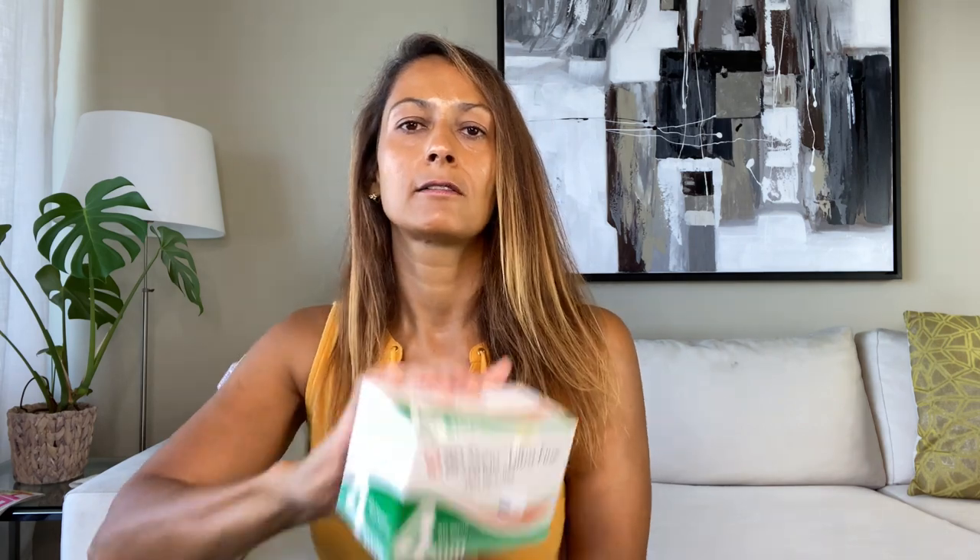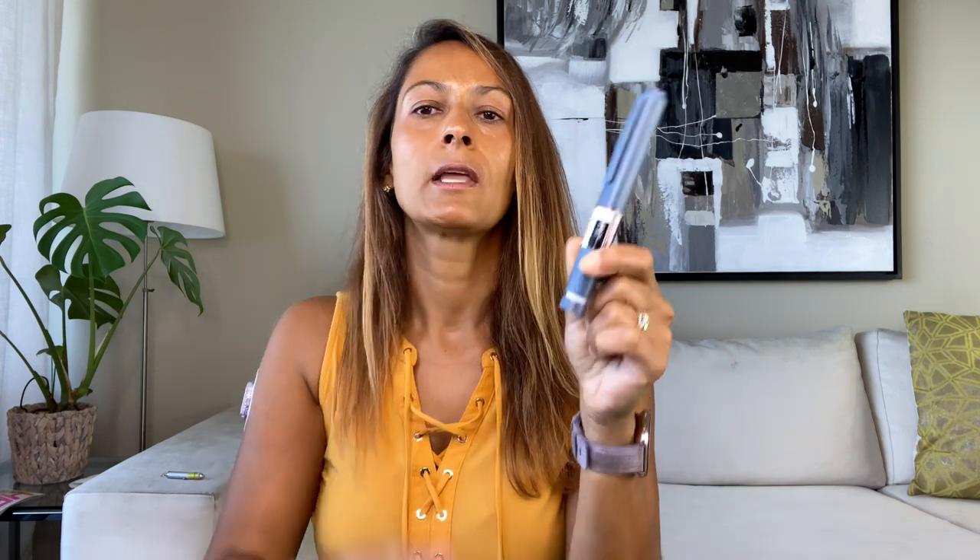Now I'm going to show you how to do an injection using a shorter needle — that's a 4 millimeter needle. I'm going to be using this pen needle that is 4 millimeters; I'll show you what the box looks like. These are the ones I usually use. What you need is your insulin pen — this is a pre-filled pen, meaning the insulin is already in here, same for durable pens.